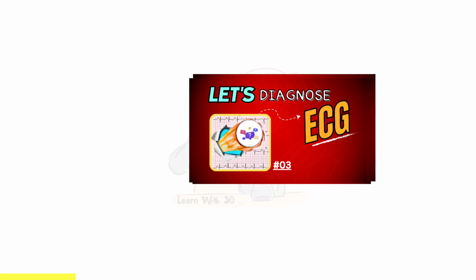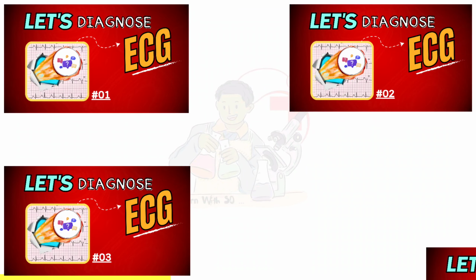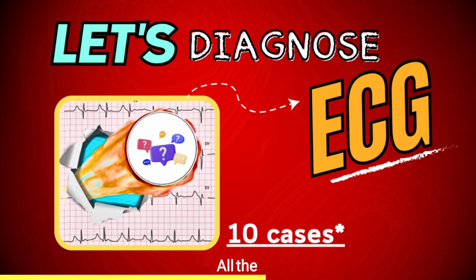As we discussed a few videos from the series Let's Diagnose ECG. Now in this video we will discuss 10 ECG cases together. So note down all the important points that you will learn from this video, and if you have any confusion regarding any question or any ECG case, you can mention it in the comment box below.